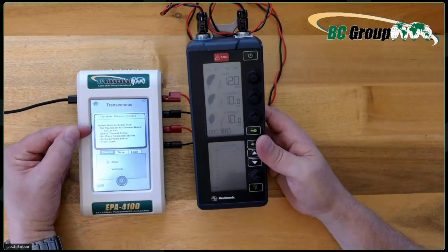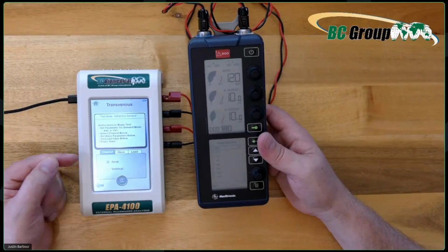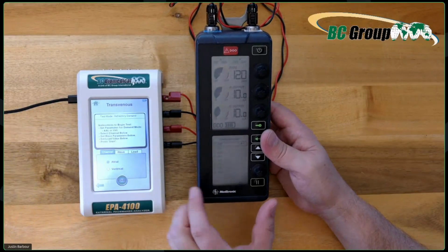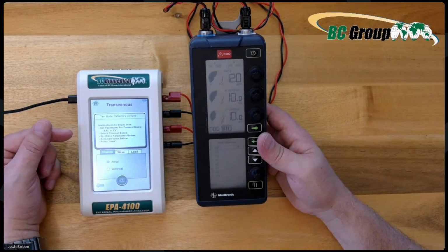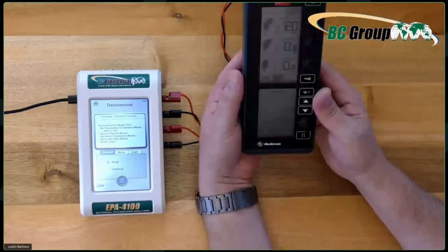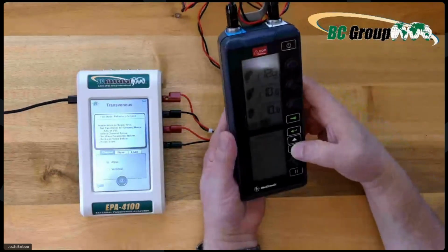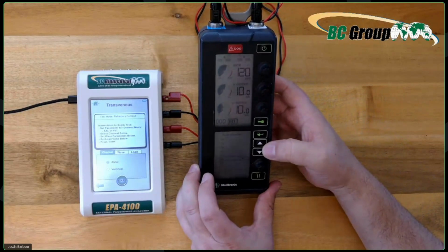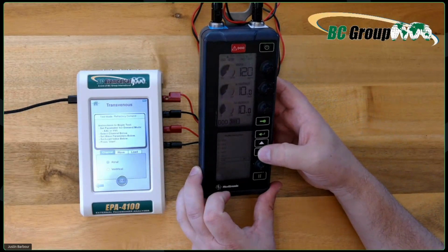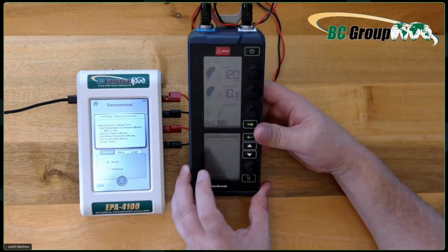Remember, if it's AAI or VVI, that's whether it's atrial or ventricle. So you have to remember that, because if you have it on atrial and you actually set it at the VVI, you're not going to get much of a result. So just remember, A is atrial, V is ventricle. You can see down here, VVI. Let's go to AAI. Let's do that right there. Enter. Sorry if you can't see this too clearly.